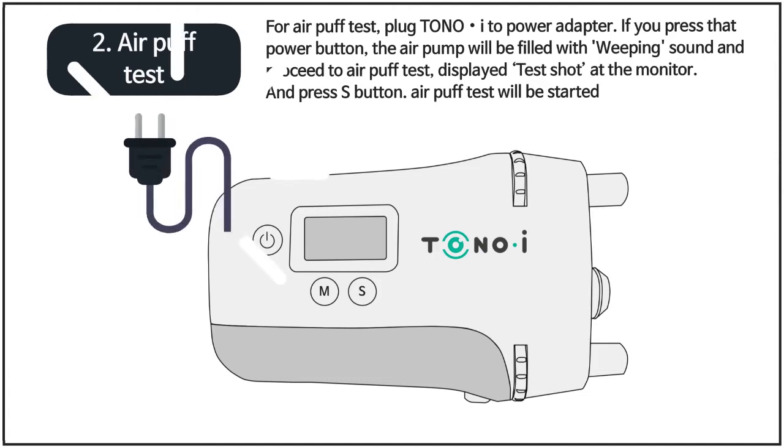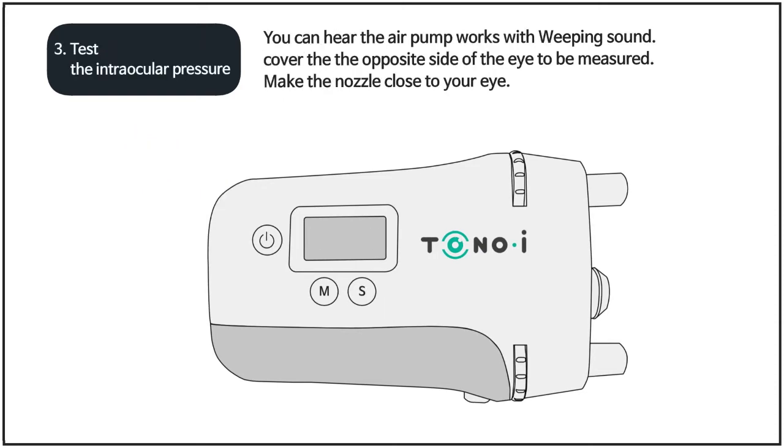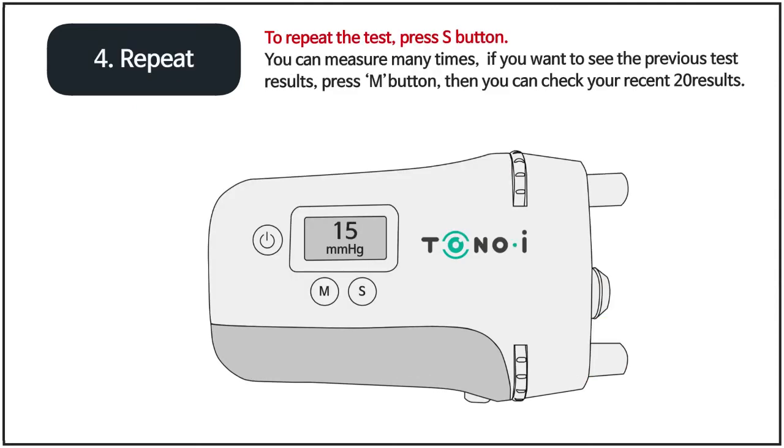Second, air puff test. For the air puff test, plug TonoEye into a power adapter, then press the S button. The air puff test will start. Third, test the intraocular pressure. You can hear the pump working with a whirring sound. Cover the opposite eye of the eye to be measured. Make the nozzle close to your eye. Stay until the guide light and nozzle change from blue to green. Control slowly until the wing reaches the end of the circle as shown. If you stay for a moment at green, it will measure automatically with the air puff. To repeat the test, press the S button — you can measure many times.